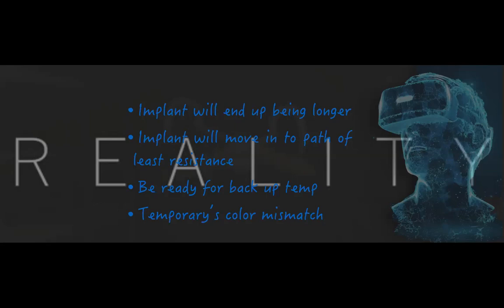Be ready for a backup temp, okay? Don't be cocky. Do not try to go ahead and sacrifice your implant. If you do not have a correct torque on that implant and it's not going in the way you want it, or you don't feel secure about the implant, don't jeopardize the implant and be ready for a backup, whether it's a Maryland bridge, whether it's going to be some sort of removable prosthesis, but don't let the patient drive the treatment. And I never promise the patient that they're going to have an immediate load. I say, we're going to try, and if we can, we'll do it.